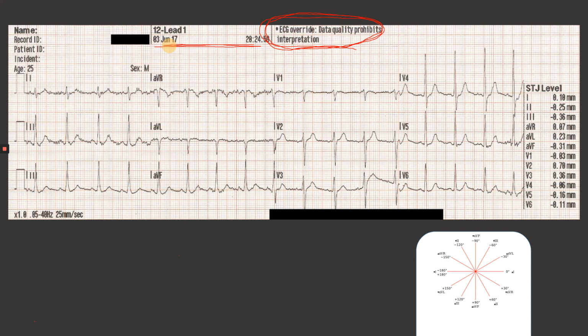So what do you do about it? Well, the method that we discussed, or that you read about, is a very safe go-to no matter what your 12 lead looks like. So, I'm only going to look at the limb leads. So that means my window is going to be just right here. These are the only things that I'm looking at. Lead 1, 2, 3, AVR, AVL, and AVF. Precordial leads, don't care. Not going to look at those for axis, okay?